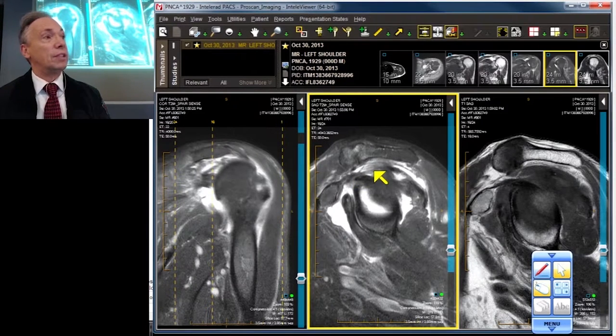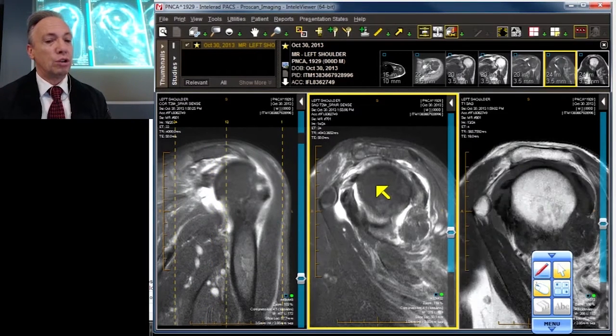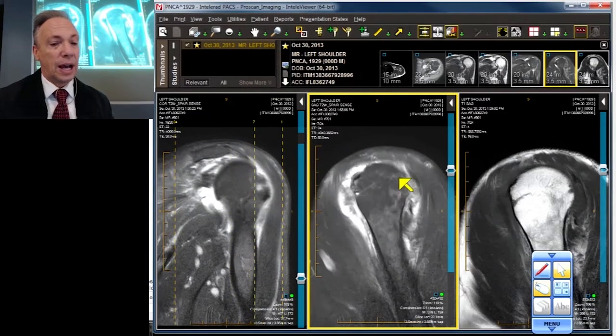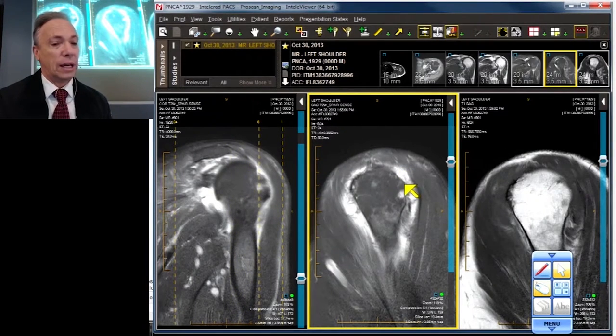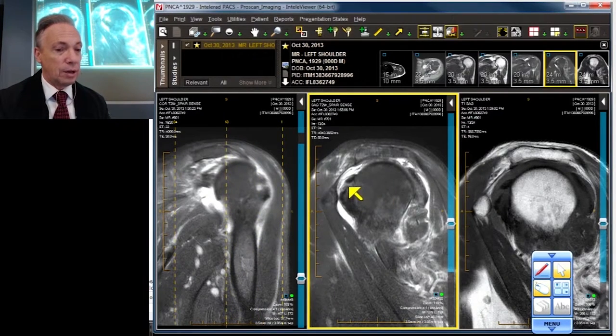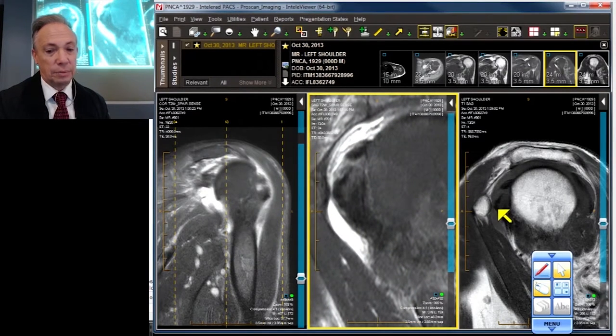There is the coracohumeral ligament — one component of it, the intra-articular component. In another vignette you would have seen that the extra-articular component is already ruptured. I'm showing this for context: the supraspinatus is nowhere to be found, the infraspinatus is also nowhere to be found, and finally the subscapularis — which is found. There is the robust superficial portion of the subscap.